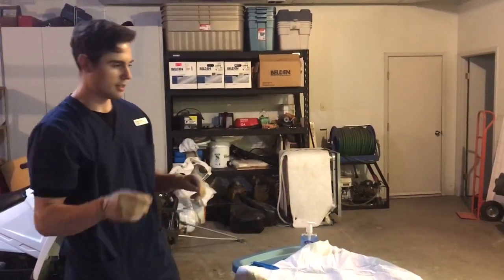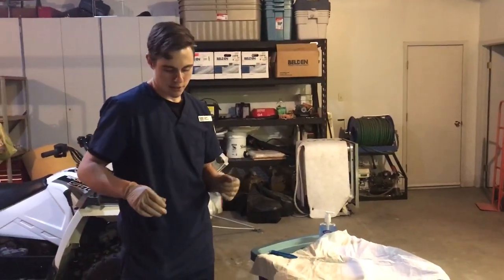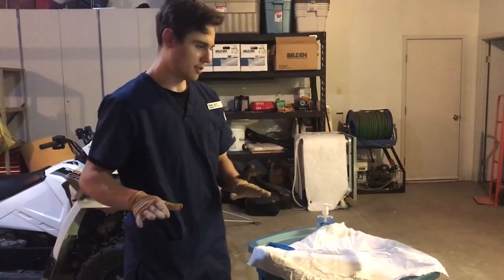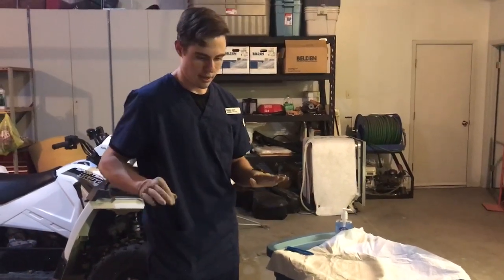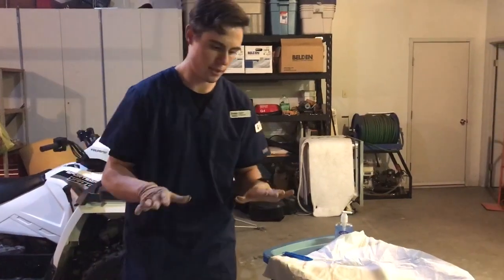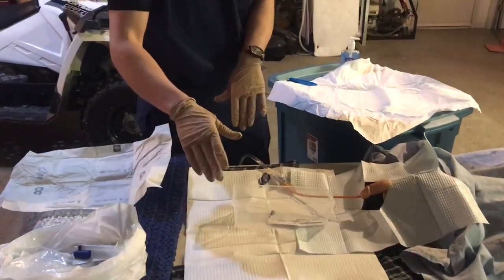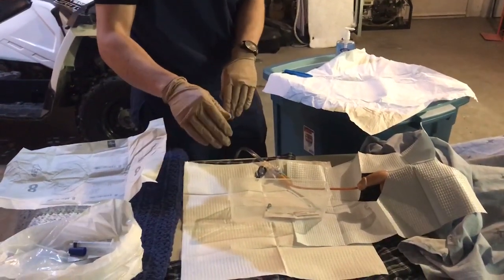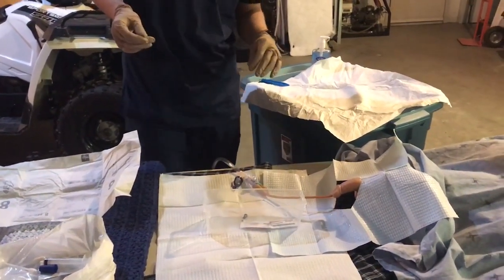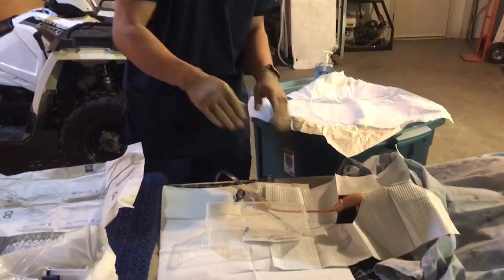So after that, I'm going to pull the curtain to maintain privacy. I'm going to fix up the bedside. I'm going to raise the bed to appropriate height. And then I'm going to position the patient in the appropriate position, so supine with legs slightly abducted, because he is male. And then I'm going to put the absorbent pad under his butt there.